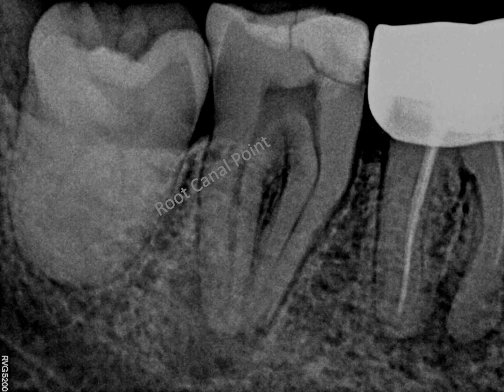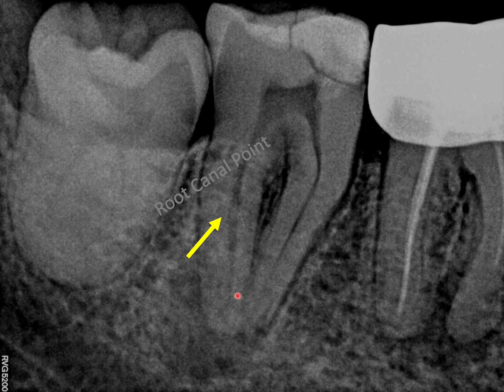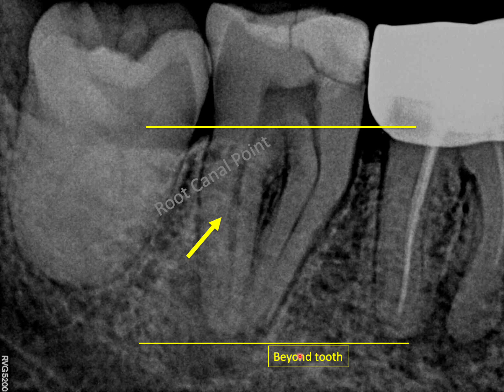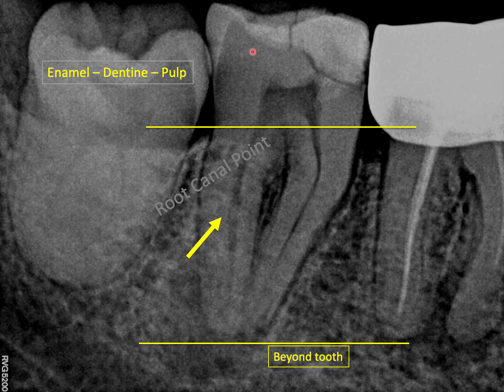Now let's move on to how to interpret a radiograph in a restorative and endodontic perspective. We need a proper IOPA with at least 5mm of the periapex visible. Once you have the correct IOPA, I generally start by identifying the culprit tooth — in this case, the mandibular second molar. I then divide that tooth into three portions: the crown, the root, and structures beyond the root. When examining the crown, I start from the enamel and look for discontinuities such as decay or fracture, then move to dentine, and then the pulp space — traveling from outside inward.